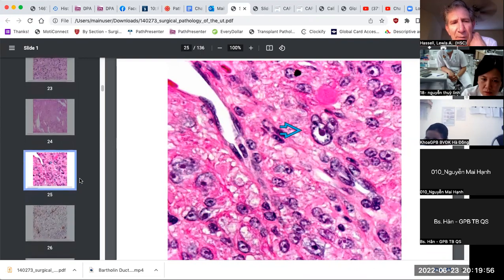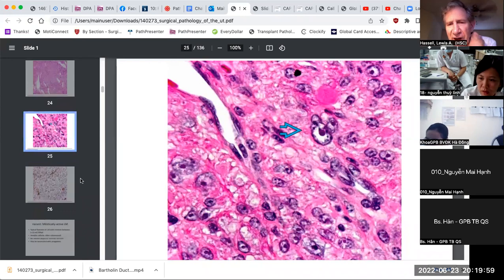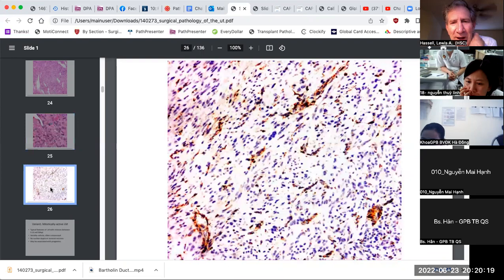I will be perfectly honest here that this is a diagnosis that I have only made very rarely. And I think the first time I made it was because my resident said, do you think this could be fumarate hydratase deficiency? And I had not considered it at that point, but she turned out to be correct. And this is what the immunohistochemistry looks like in these tumors. The vascular cells and benign stroma will express fumarate hydratase, but the tumors will be negative. This is usually a cytoplasmic stain.